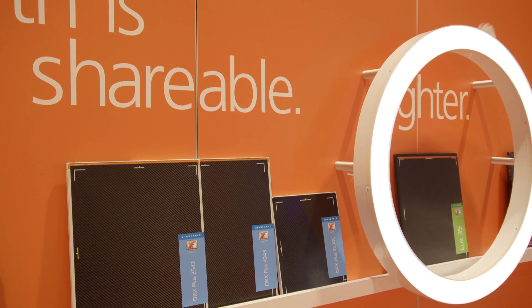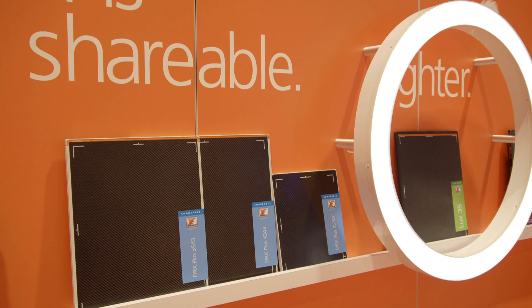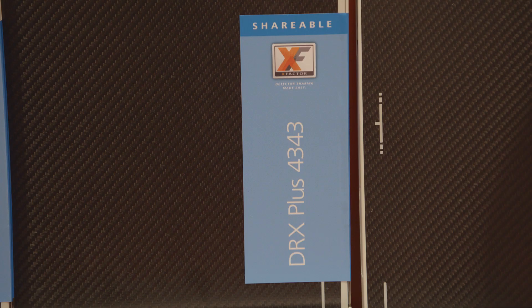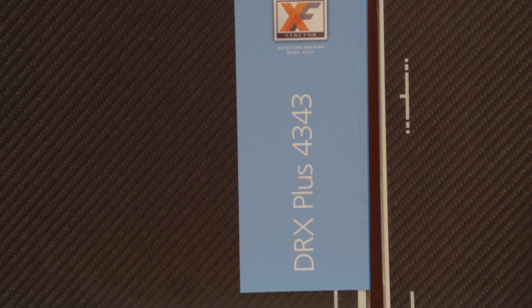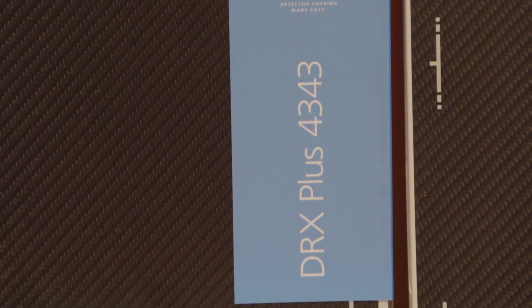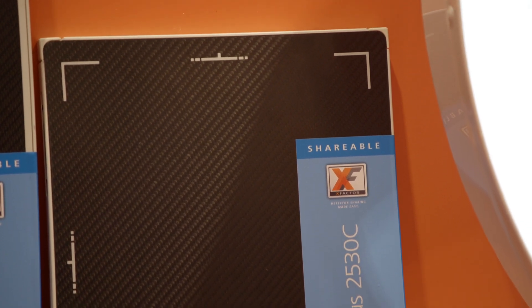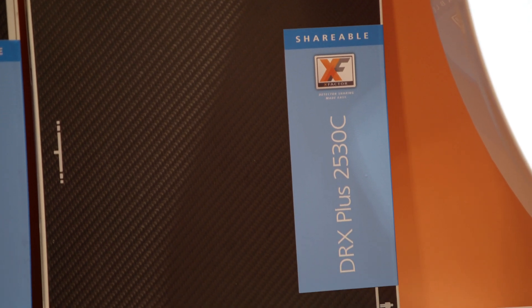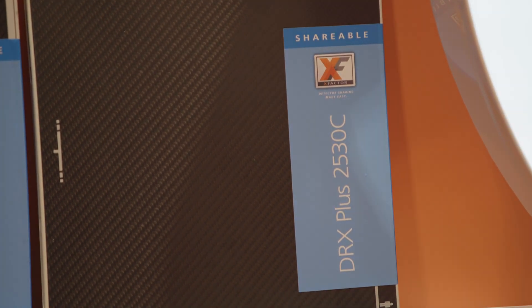All of our DRX Plus detectors have an IP57 rating. The 35x43 and the 43x43 have a 139 micron pixel pitch and are available in both CSI as well as GOS formats. The DRX Plus 2530C detector has a 98 micron pixel pitch and uses a CSI scintillator for dose-sensitive applications.